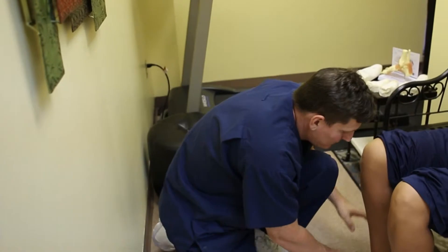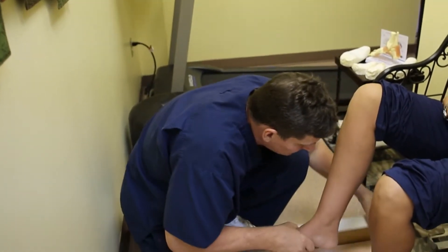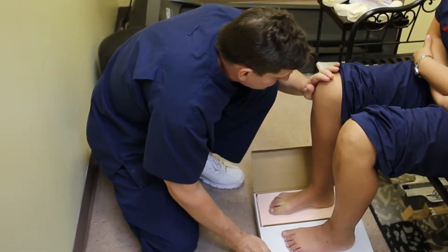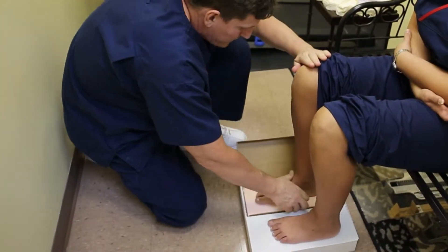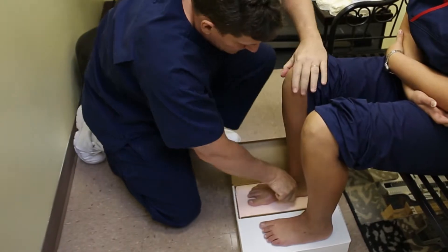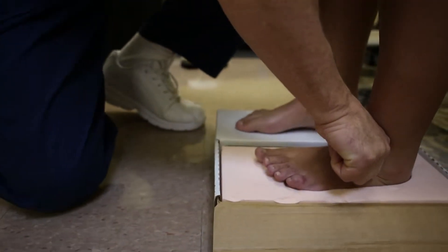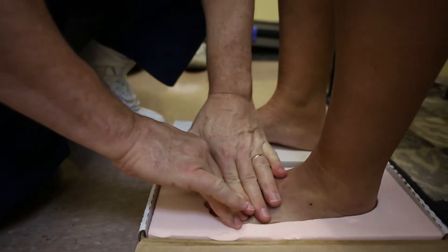The foot is designed to unlock or pronate when it hits the ground for shock absorption and to conform to variable terrain. When either of these phases are excessive or out of sync, the foot has faulty mechanical function. We use an orthotic as a supportive device to be placed inside the footwear to change the mechanical function of the foot.